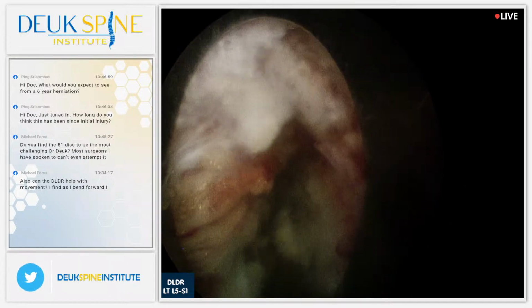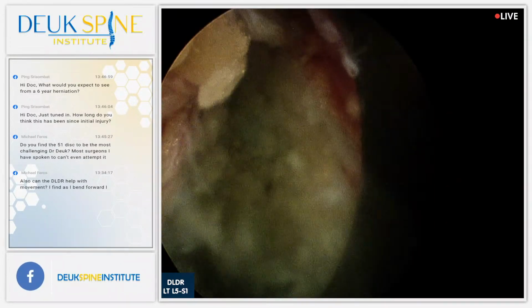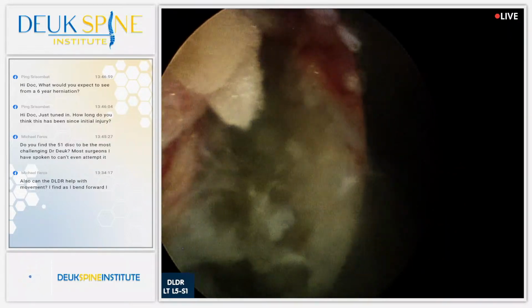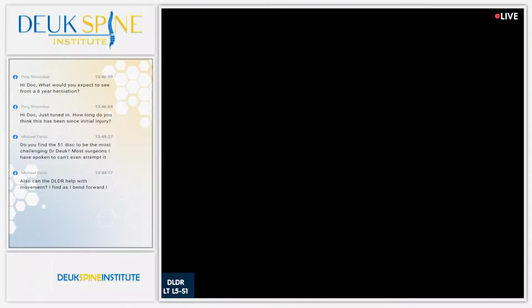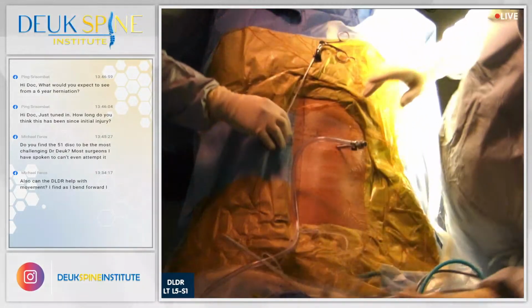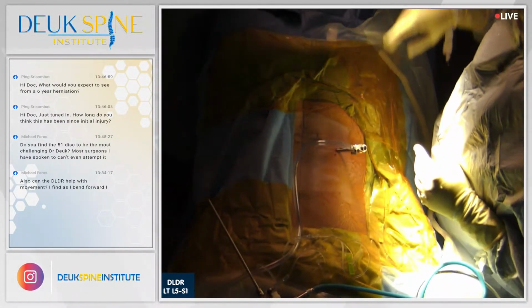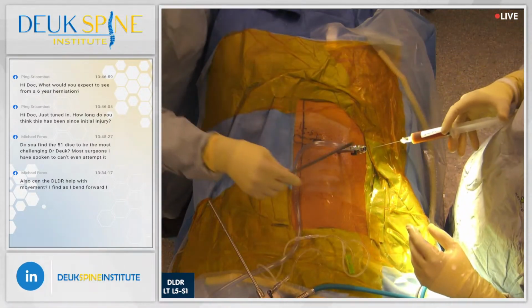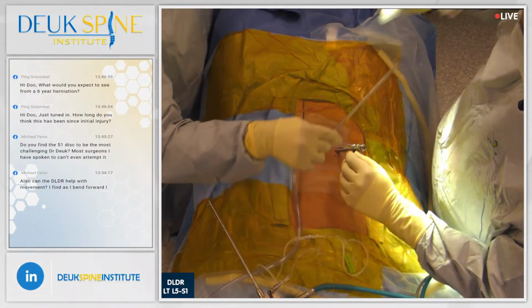And we're pretty much done. The nerve root's going to be buried in that fat. There's the disc where the tear was. That should heal up nicely. His surgery went very well. I'm pleased. I couldn't really grab or get out any more of the herniation. Any questions, feel free to ask me. We're going to put some antibiotic.